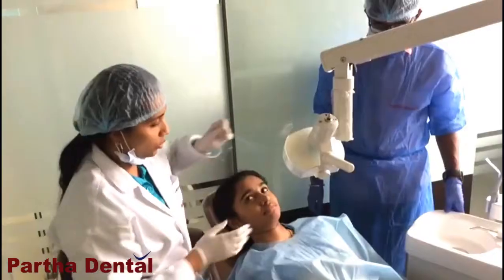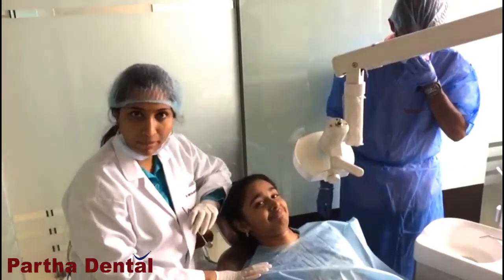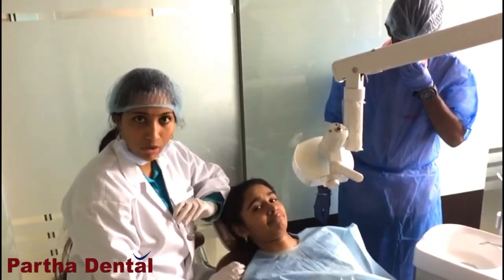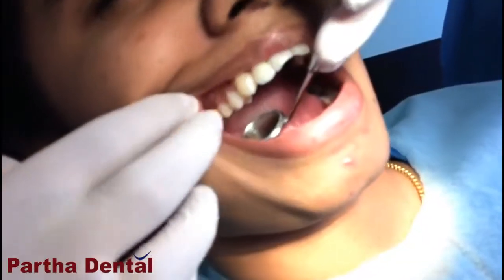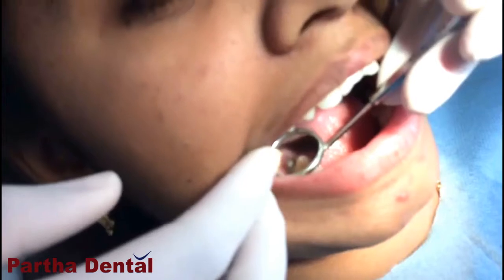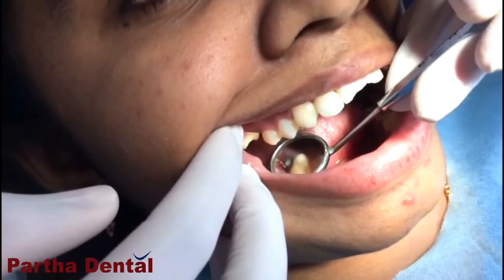Right now, for the extraction of the tooth — the patient is Nithya Meenal. We have the implant placed here. Can you see this? This is the implant underneath. We have placed the implant immediately after the extraction.